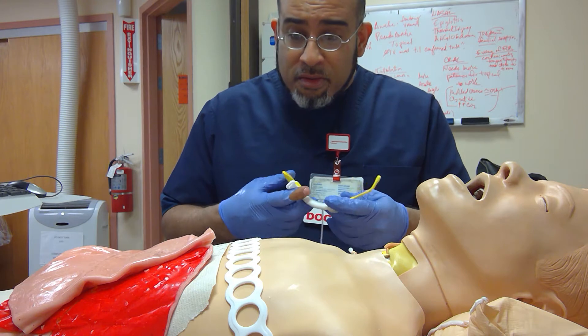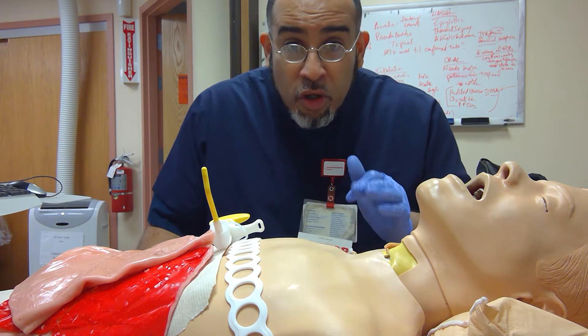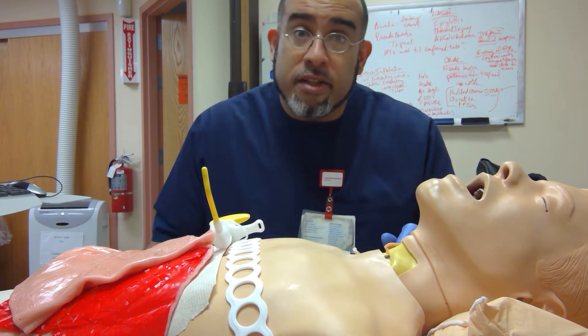Mind you, this is going to be recommended to the military. Regardless of what color it is, they're taught the surgical airway without bright lights, because otherwise you have a sniper hitting you and killing you while you're trying to save your colleague's life.